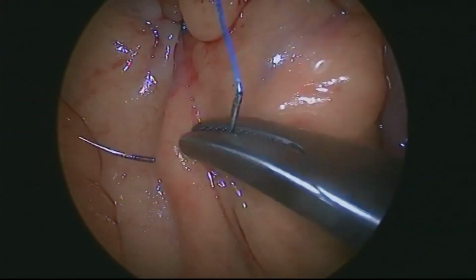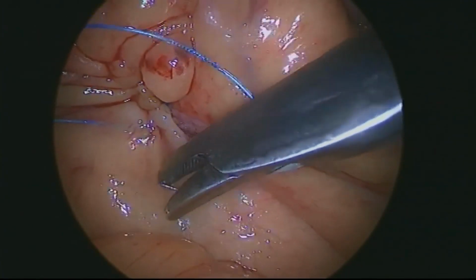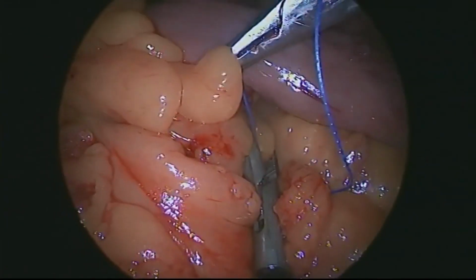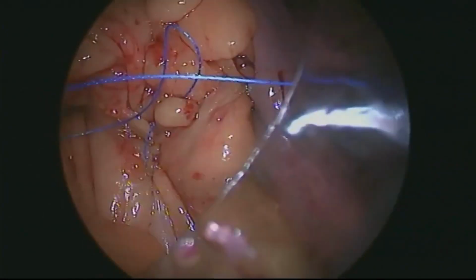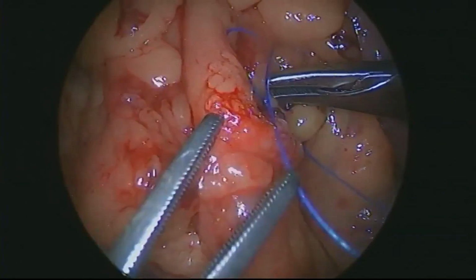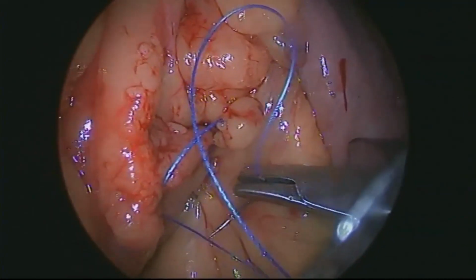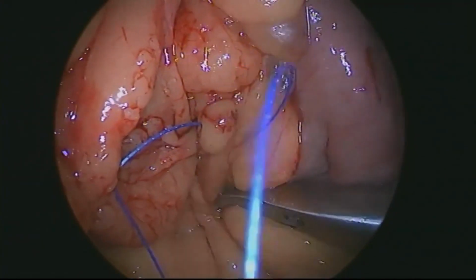the dimple that is actually the testimonial that we reached the bottom of the defect, of Peterson's defect. So we have to make sure that the closure is tight, and again we will have a look to make sure that we did incorporate the dimple that's always there between the two mesenteries, and here you see how sometimes it's a little bit painstaking, but we need to do that for our patients' safety.